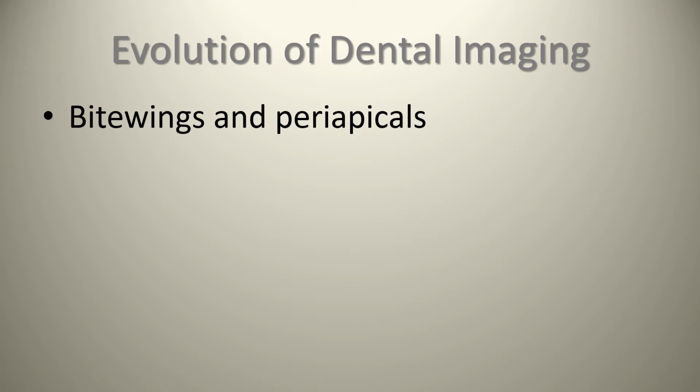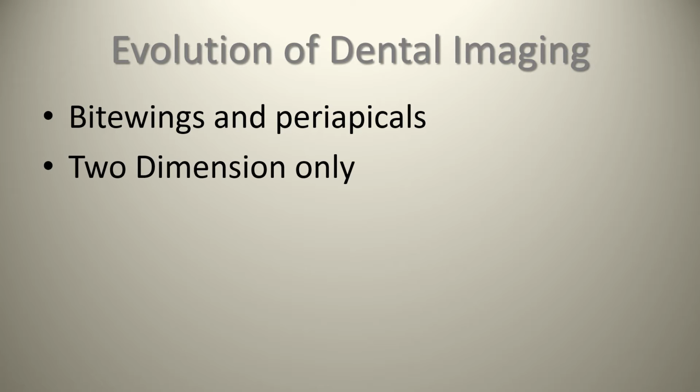What we have realized from the first day that we started in oral radiology was that a radiograph is a two-dimensional image, and you can do things like the buccal-lingual sliding move, the same lingual opposite buccal, in terms of moving the radiograph and taking X-rays in two dimensions to determine which object is in relation to the other object, either on one side or the other.